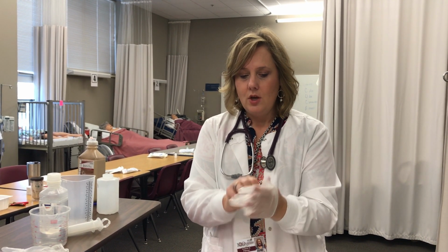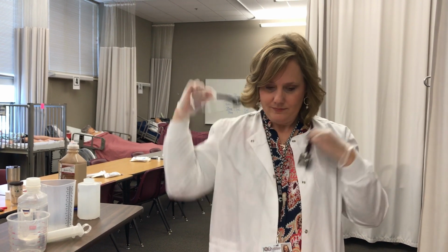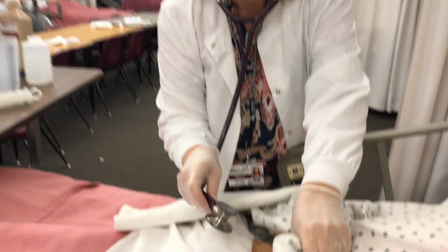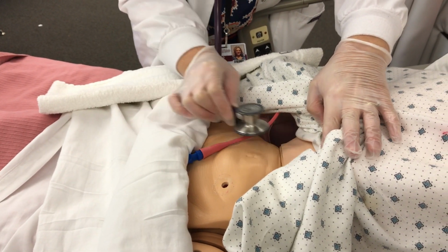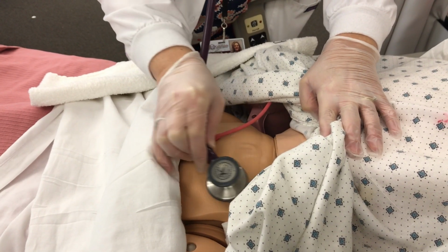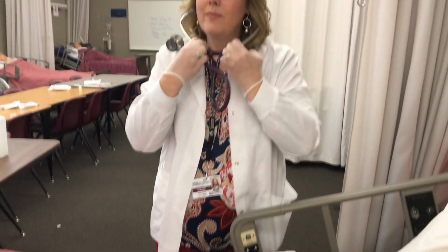The next thing that you'll want to do is assess for bowel sounds. So you can don your gloves. When you assess for bowel sounds, you'll want to assess in all 4 quadrants, and you'll also want to put the stethoscope to the skin of the client. Okay, I do hear active bowel sounds.